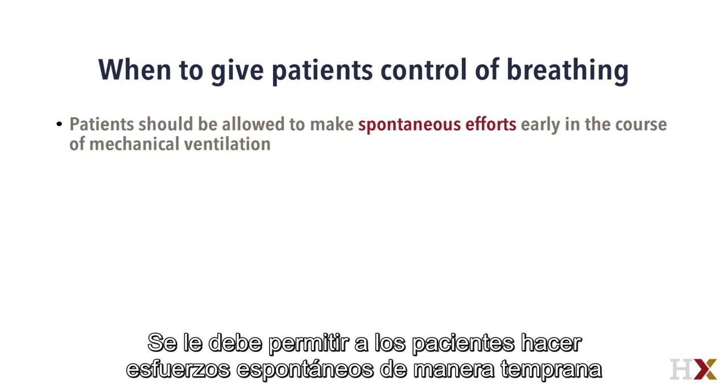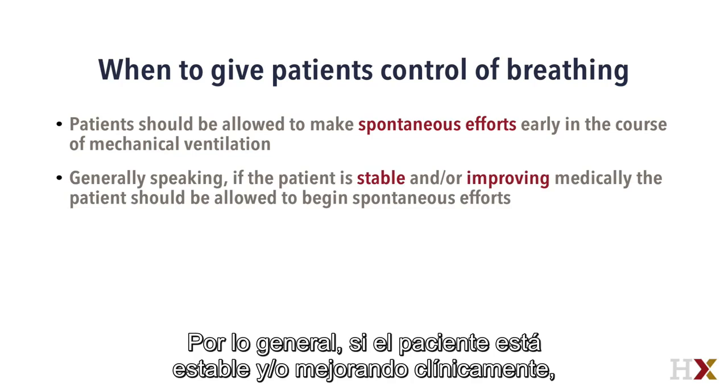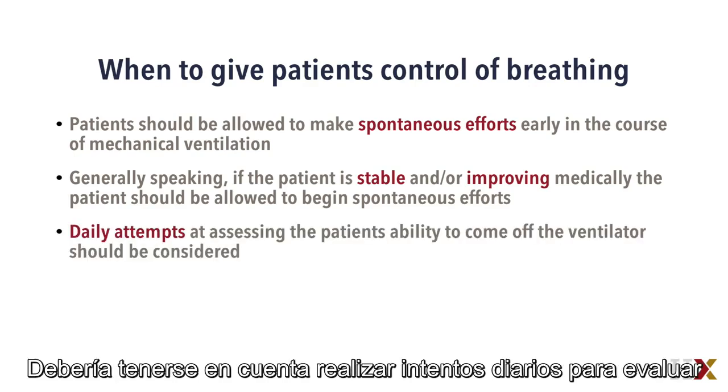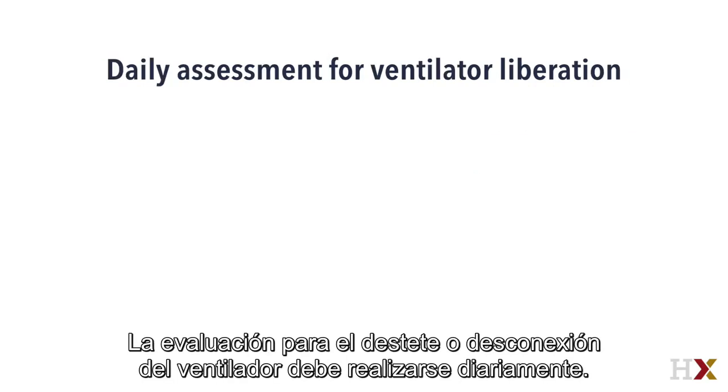Patients should be allowed to make spontaneous efforts early in the course of mechanical ventilation. Generally speaking, if the patient is stable and/or improving medically, the patient should be allowed to begin spontaneous efforts. Daily attempts at assessing the patient's ability to come off the ventilator should be considered. The assessment for ventilator liberation should be done daily.